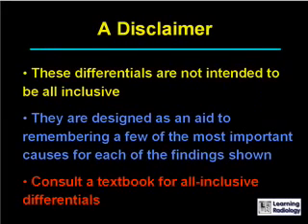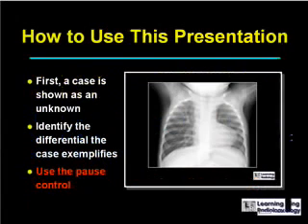These differentials are not intended to be all-inclusive. They're designed as an aid to remembering a few of the most important causes for each of the findings shown. The way the presentation works is that first a case is shown as an unknown. You identify the differential that the case exemplifies. Make frequent use of the pause control on your computer or MP3 player.